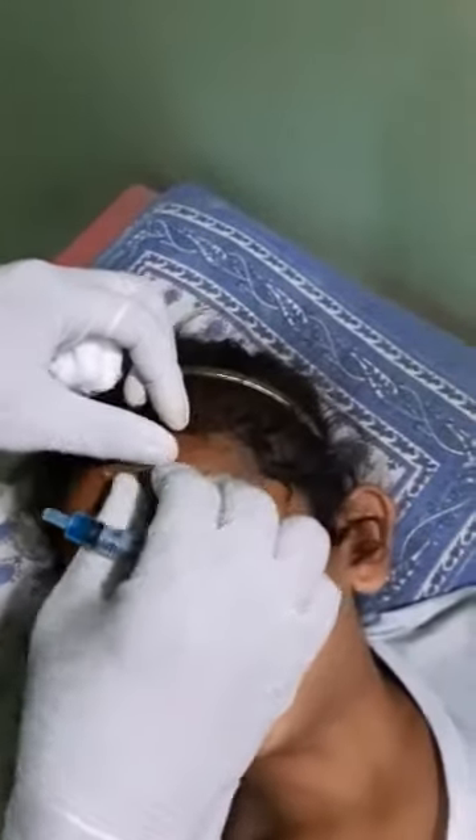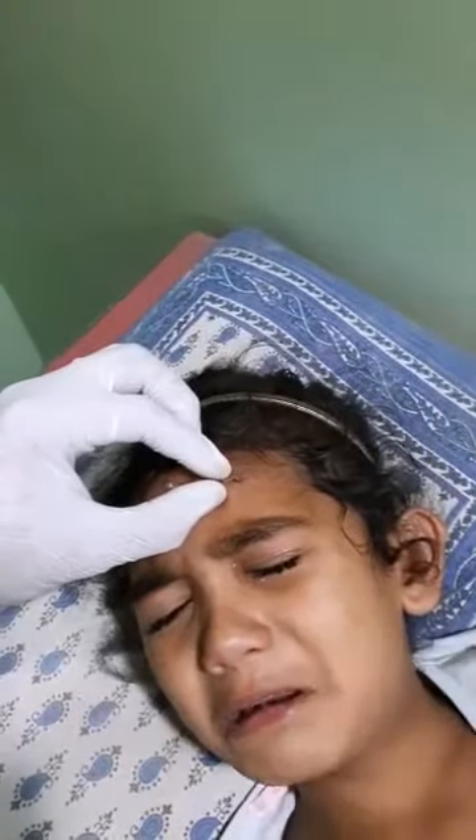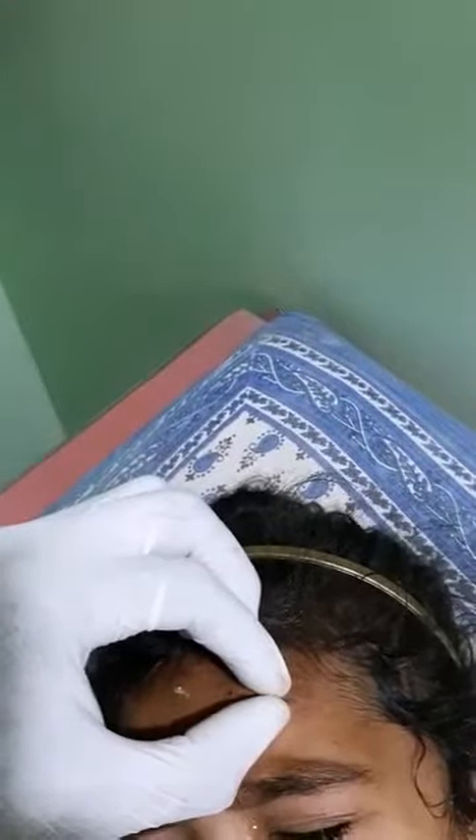We are having a solution — cut seal solution — which is an adhesive solution that will seal the whole wound within seconds. This is a very good solution especially for kids who are afraid of injections and sutures. Thank you.